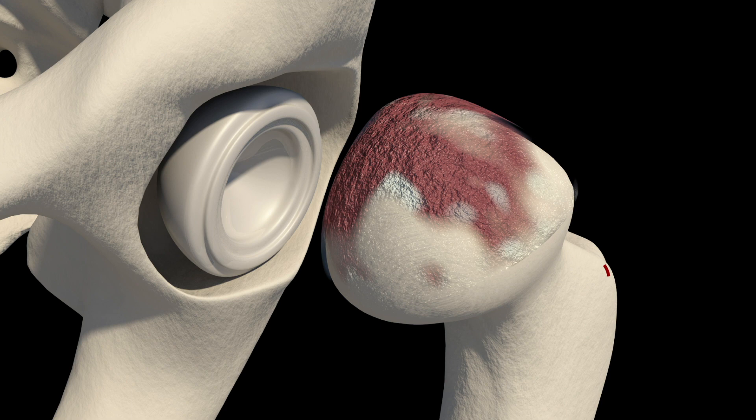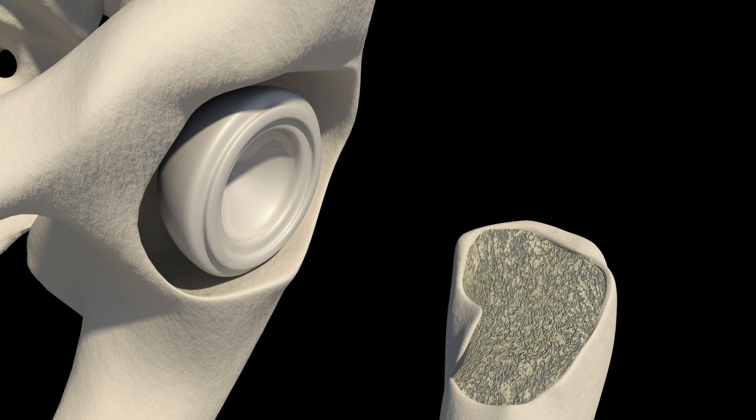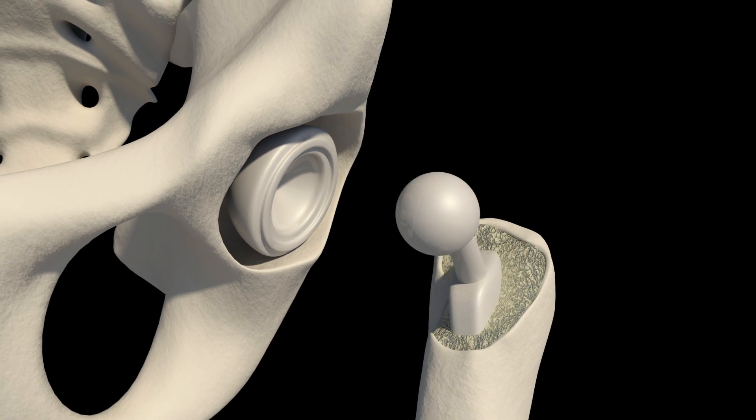The surgeon secures the prosthesis in place using special cement or screws. On the femur, the surgeon removes the femoral head, shapes the remaining femur to fit the prosthetic stem, and secures the femoral component using cement or other techniques.